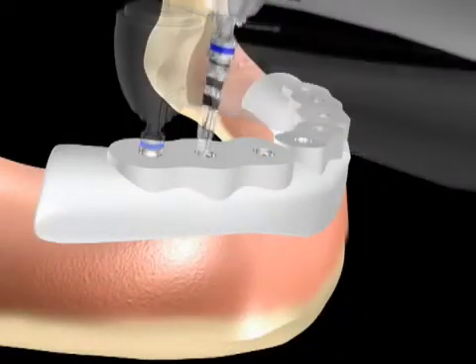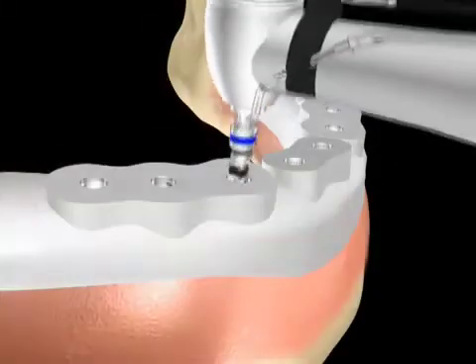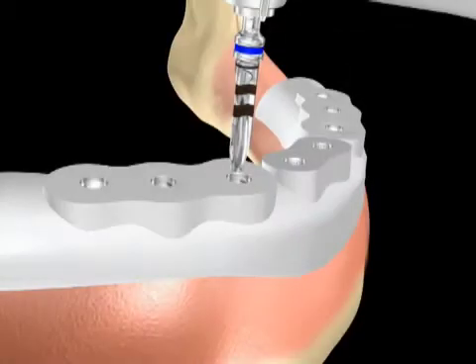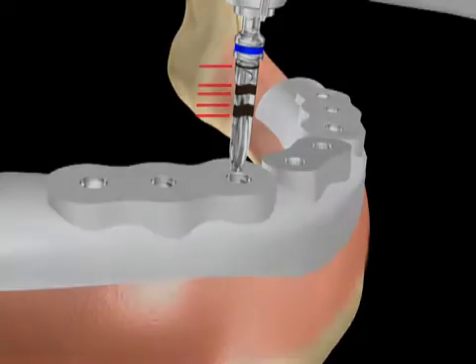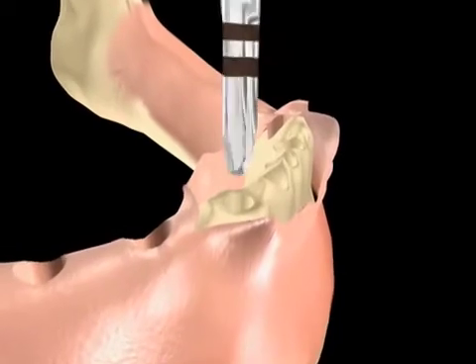Progressively larger diameter drills are then used in sequence. The Intraloc drilling guide will indicate the sequence of drills to be used at each location. Each drill is color coded and has laser etched depth marks located at 8, 10, 11.5, 13, and 15 mm. The final drill concludes the preparation of each site.